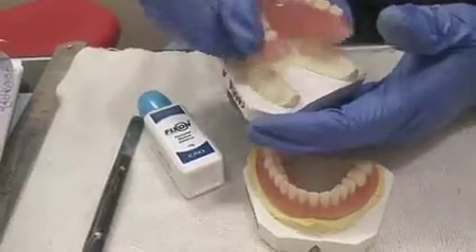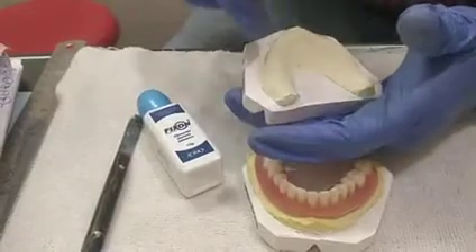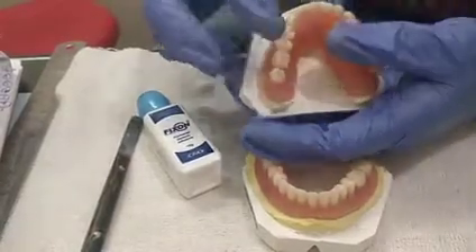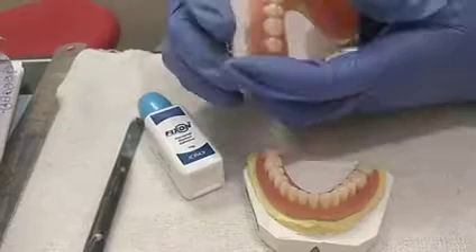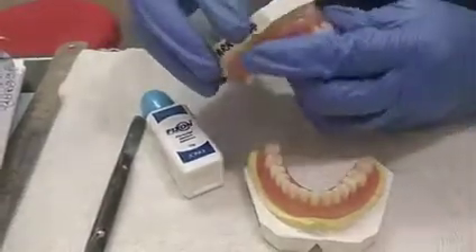I have tried to make the impression, however it is also not to the posterior palatal seal area. So this is how it is not in good retention.